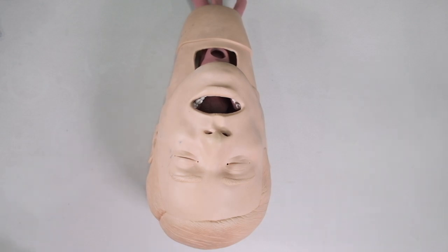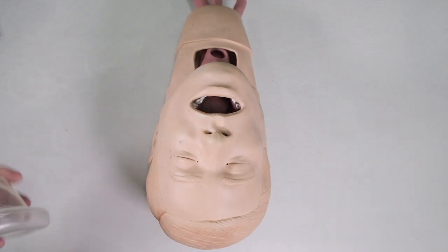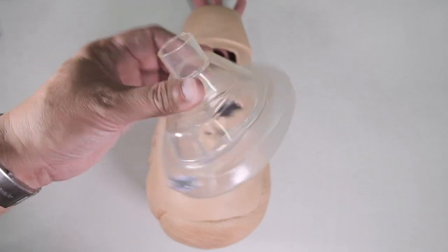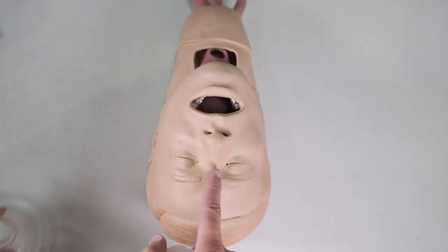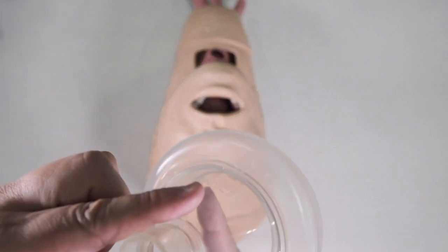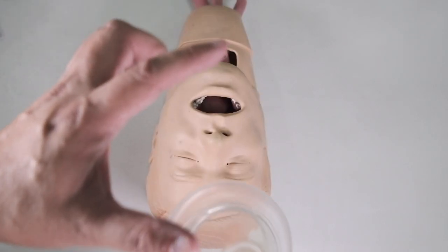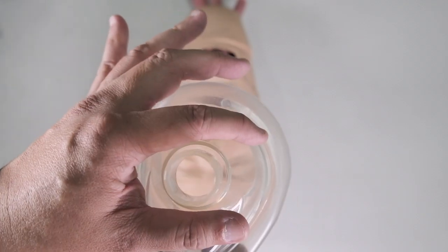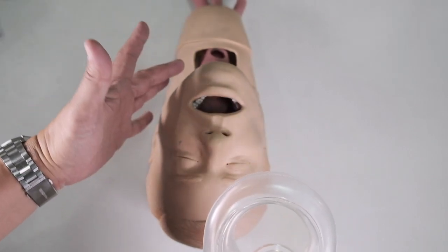So this is the mannequin that we're going to use to demonstrate the EC grip. Again, just to review, this is the face mask and this is the nasal part, which goes here to this part. The round part, this one, goes to the mandible, this one. And the C of the EC grip goes here. The E of the EC grip goes to the patient's mandible here.